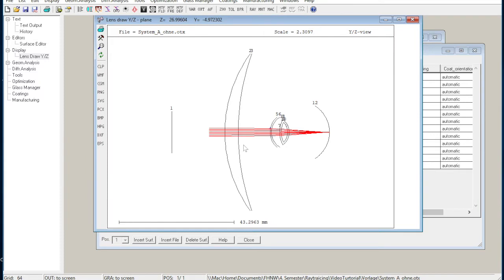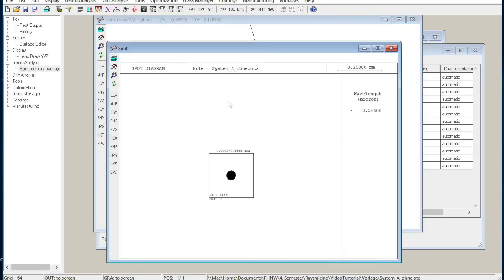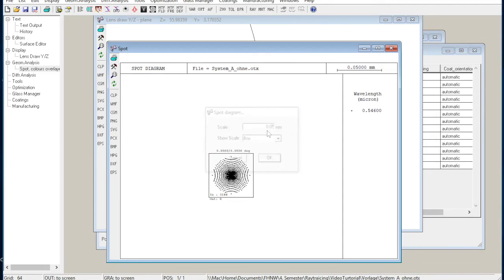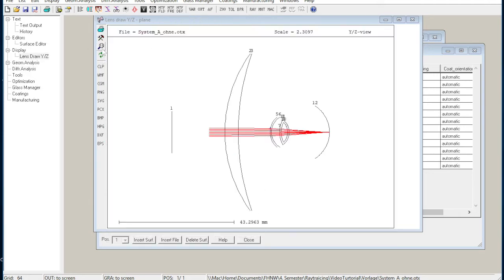And that's how the lens looks like. And there we go. We have a nice focal point on the retina. You can see it here on the spot diagram too. Let's change the scale to 0.05 mm so we can see it better, and yeah, a wonderful pattern. Now we would like to optimize the lens, but how can we do it?